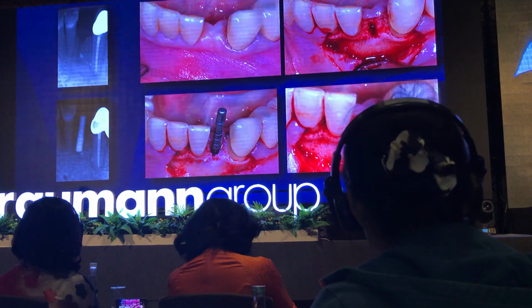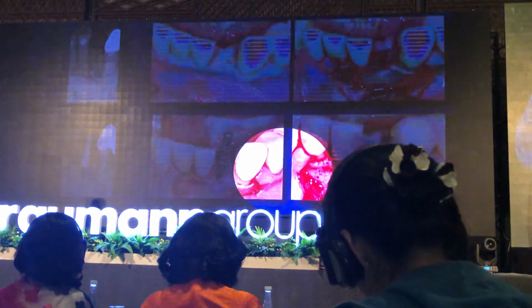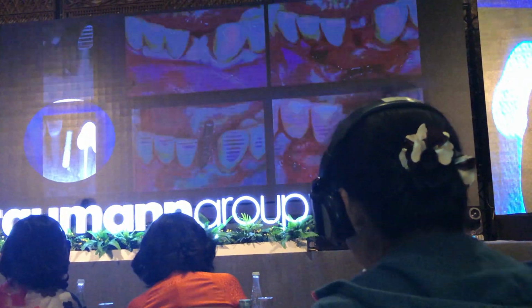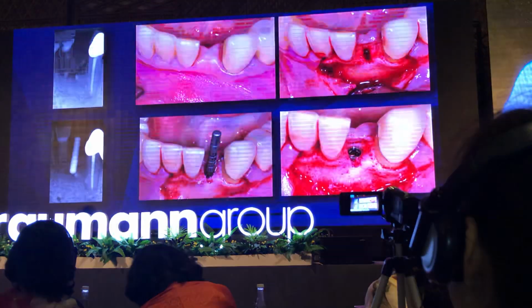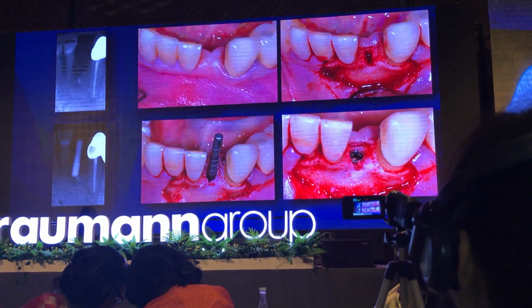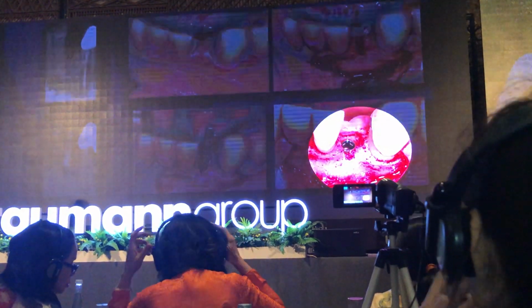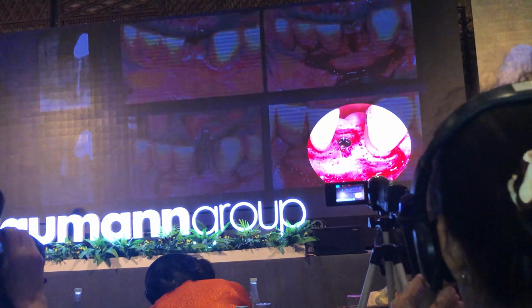Not much. So we do an implant bed preparation, and you see also when we prepared this, we put in the depth gauge and take a radiograph. I want to see where we go. I realize I have to change direction a little bit. So we changed that, and then the implant was placed. So you see there is enough spacing to the mesial root and to the distal root. The buccal defect is not really big.